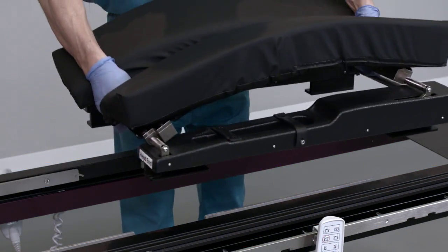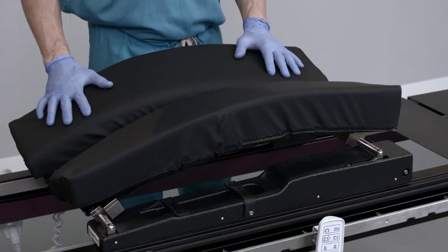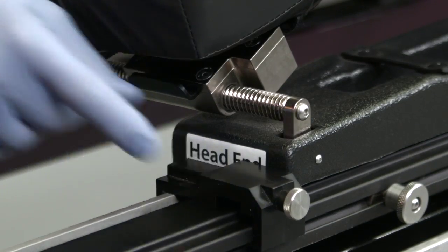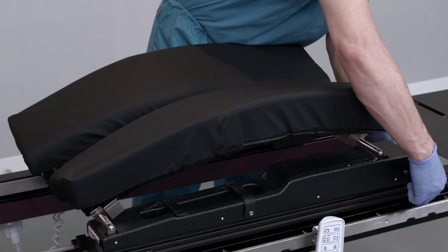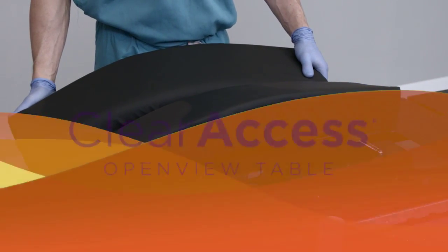To begin, install the FlexFrame onto the prone platform by inserting the feet into the gaps on the inner rails of the prone platform. Slide forward toward the head support and secure it in place with the utility locks, immediately adjacent to the FlexFrame at the head and foot end of the platform. Click on the link at the end of this video for more detailed instructions on the use of the FlexFrame.